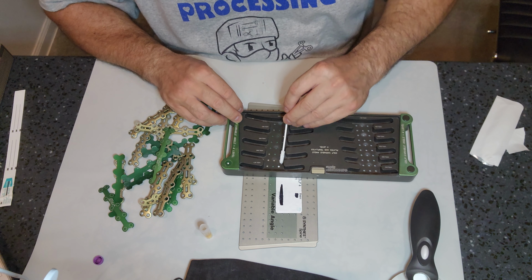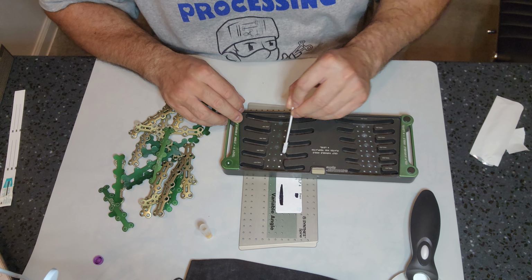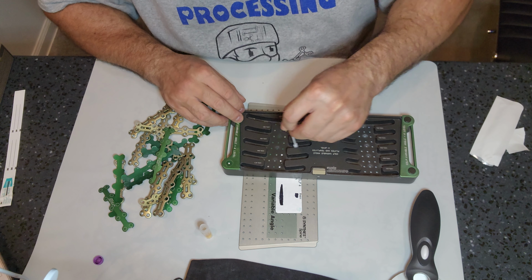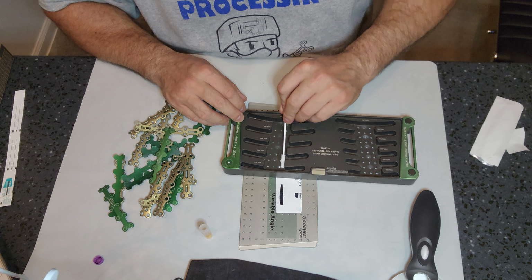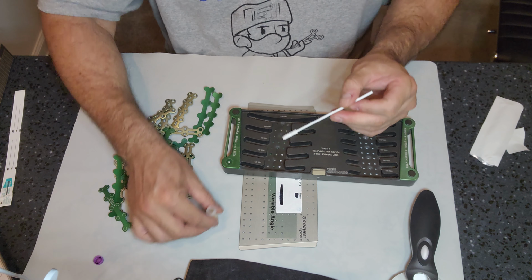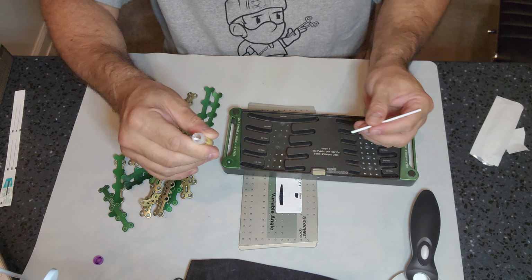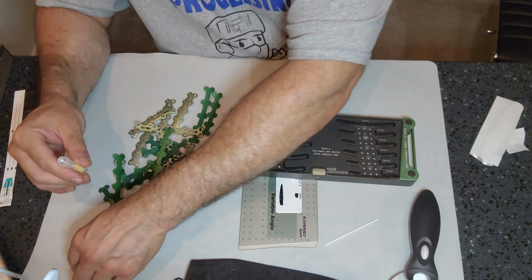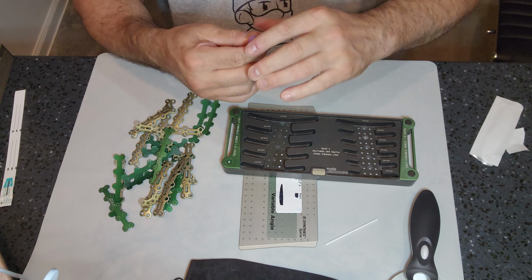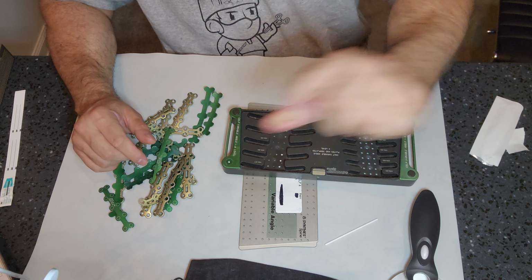Now, I feel that it is a rough area, right? So I know it's not part of the tray. And I'm going to swab different areas of this tray as well. Okay, might as well get a big area. Okay, and then this piece here, I'm going to go ahead and place in the vial. And I'm going to break the tip off just like so. Okay, I'm going to place my cap on. And I'm going to agitate this for about 5 seconds or so.